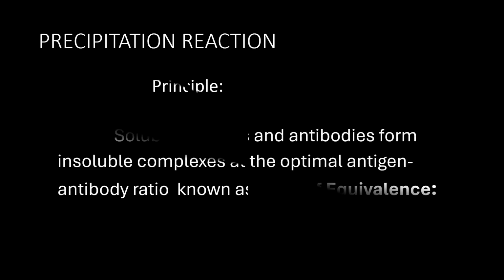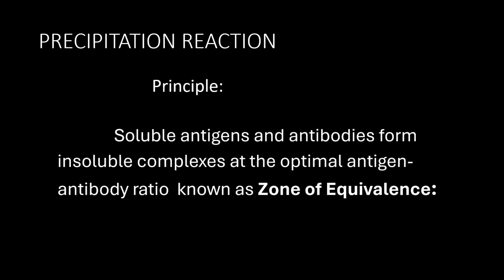First, dealing with precipitation reaction. Precipitation means formation of insoluble complexes in aqueous solution. In this reaction, there is soluble antigen present and antibodies present in the patient's blood. Once they interact together, they are going to form insoluble complexes at the optimum antigen-antibody ratio, which is known as the zone of equivalence.